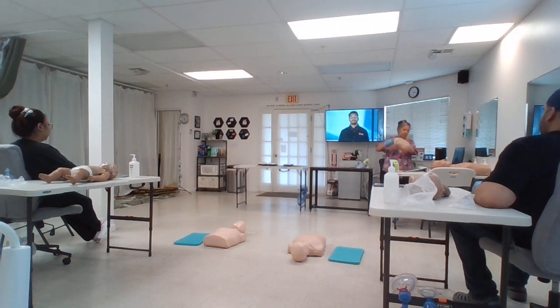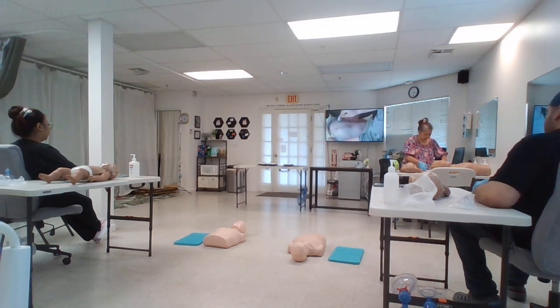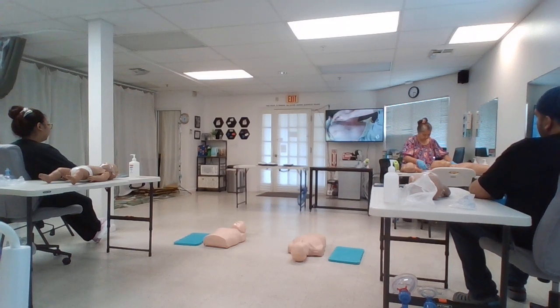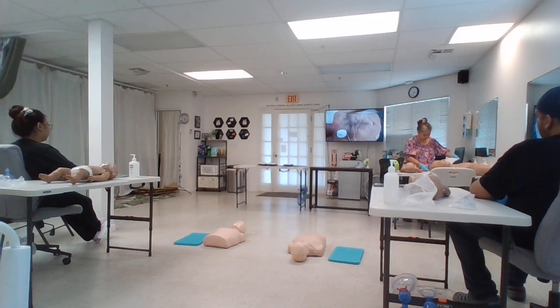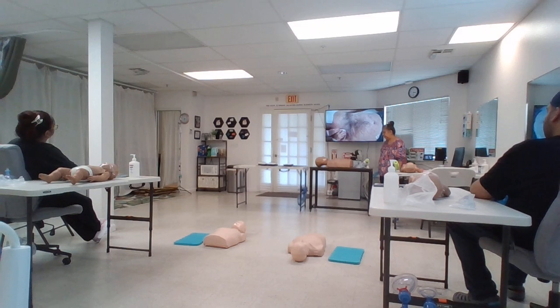You'll need to consider a few special situations when using an AED. First, if the person's chest is so hairy that the pads can't adhere to the skin, you may quickly shave the area if a razor is provided. If no razor is provided and you have 2 sets of pads, apply 1 set to the hairy chest. If the chest hair prevents the pads from contacting the skin, the AED should tell you to check the pads. If it does, press them down more firmly. If they still aren't sticking, rip the pads off forcefully, removing the chest hair. Then, apply a new set of pads to the bare skin.